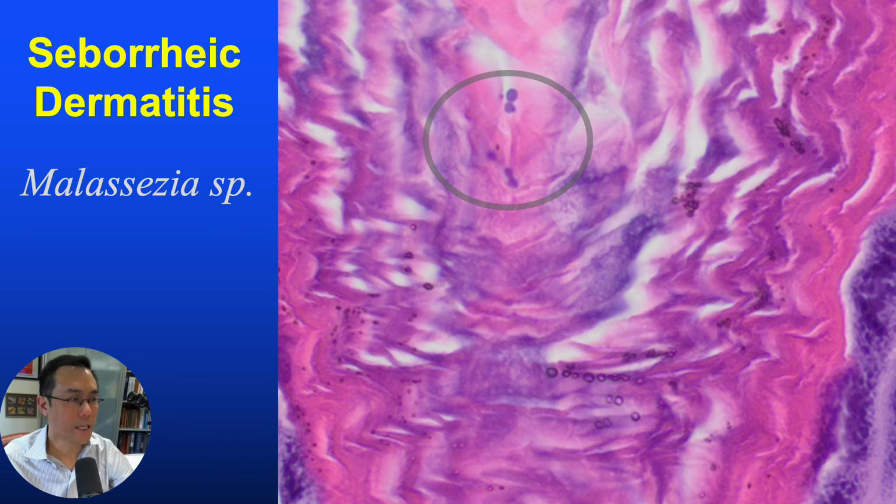And if one were to scrutinize the cornified layer, the stratum corneum, or the cornified portion of the follicular infundibulum, yeast spores, presumably various species of Malassezia, are typically seen, corresponding with the typical head and neck distribution of Malassezia colonization and seborrheic dermatitis.